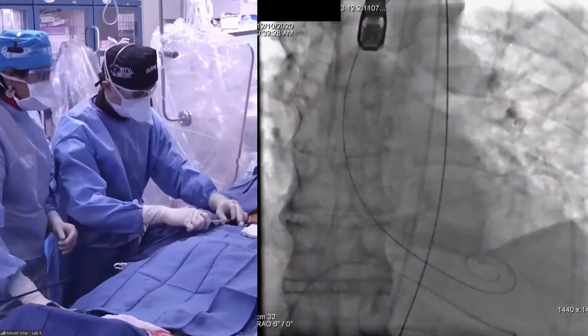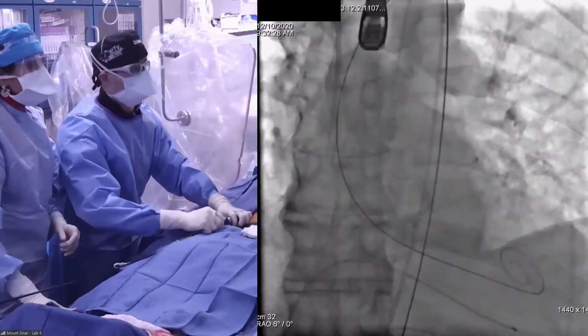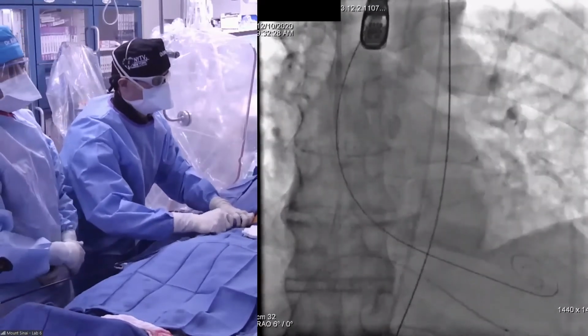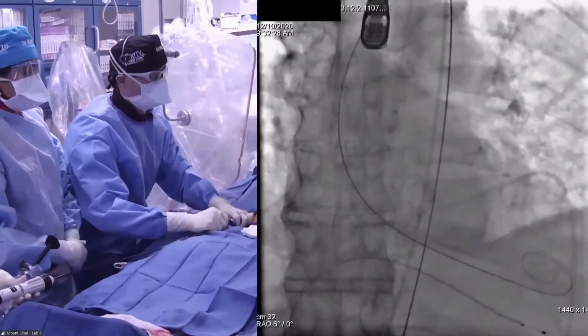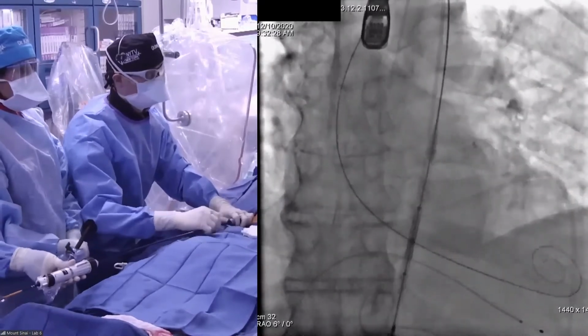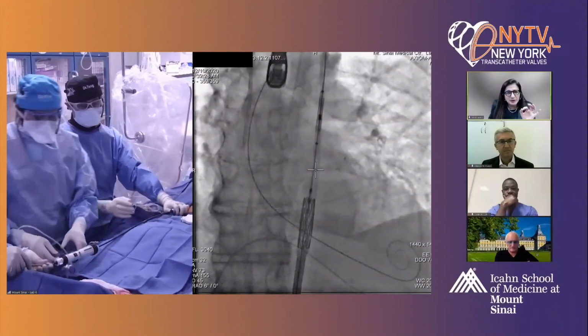Let the wire go a little further. Yep. And this wire, the valve needs to be adjusted to bring it on the balloon once into the aorta in this view, and try to move as little as possible. Keep your view, which you're going to implant. Good. Please go through the steps one by one, Gilbert.